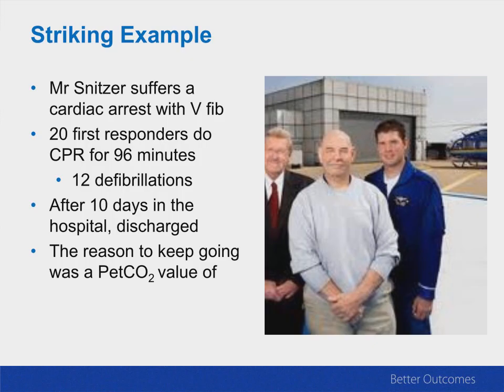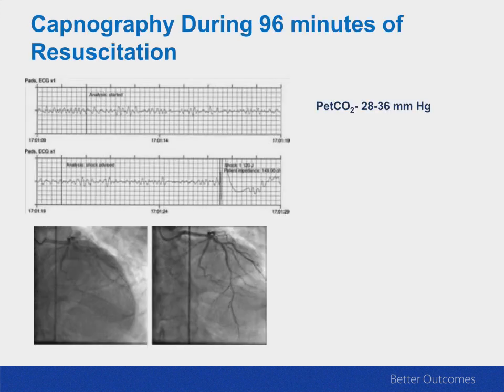And we'll give an example. This is well documented in the literature. This gentleman had a very long resuscitation and survived. This was a 1.5 hour resuscitation, very, very unusual. But the thing that made this a striking example was his end tidal CO2 level the whole time.